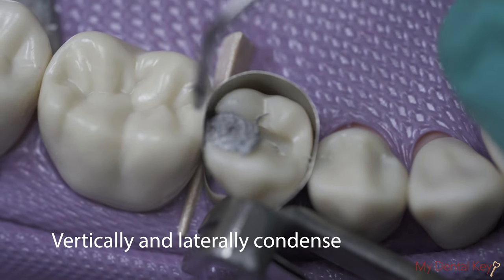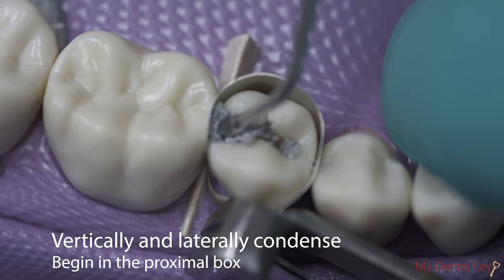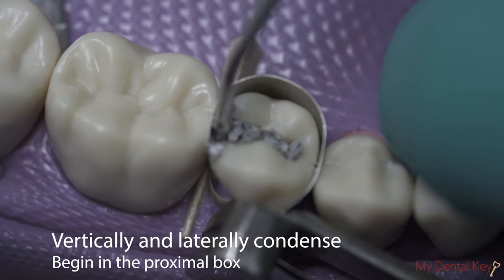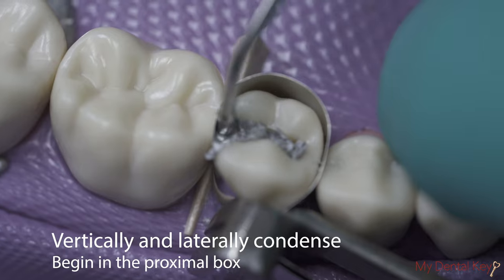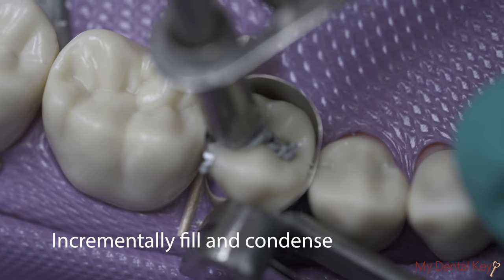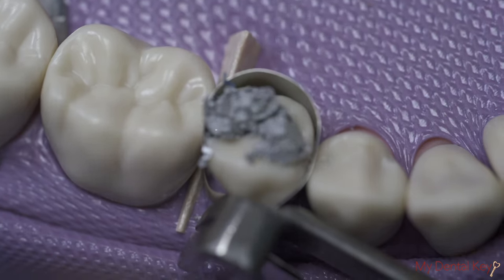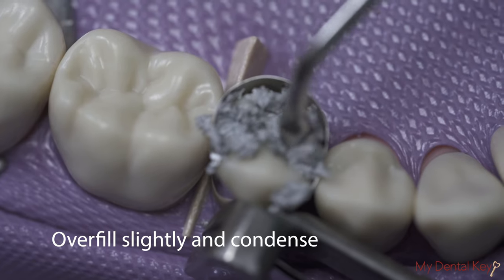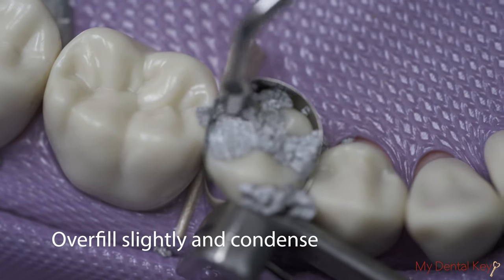Use the smallest condenser to vertically and laterally compress amalgam into the preparation. Use the amalgam carrier and condenser to incrementally fill and compress amalgam into the preparation. Slightly overfill the preparation with amalgam. Use the largest amalgam condenser when the amalgam fill reaches the occlusal surface.